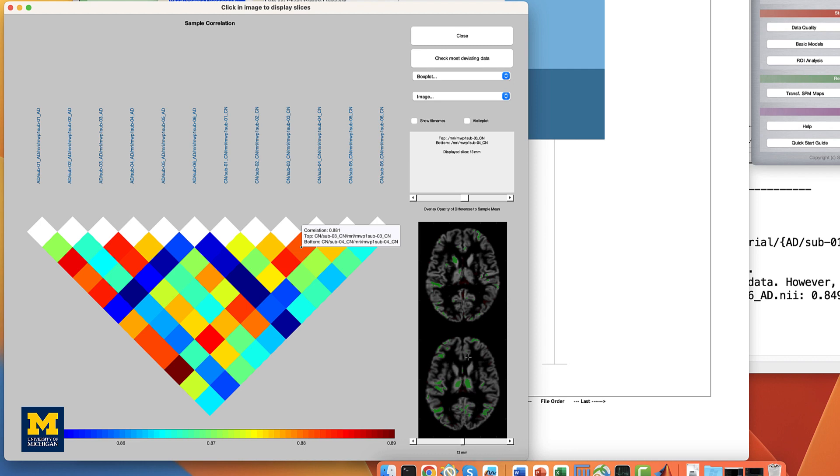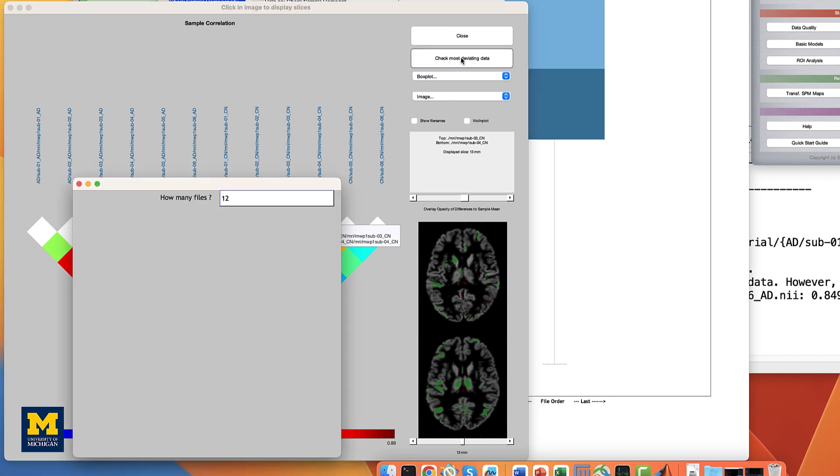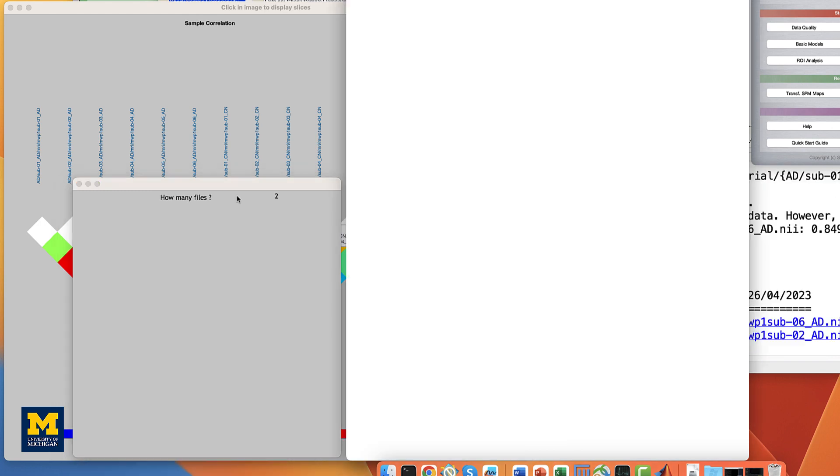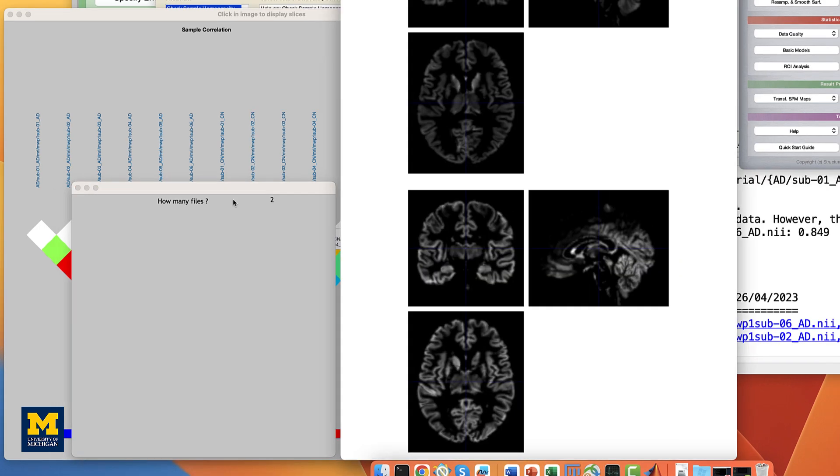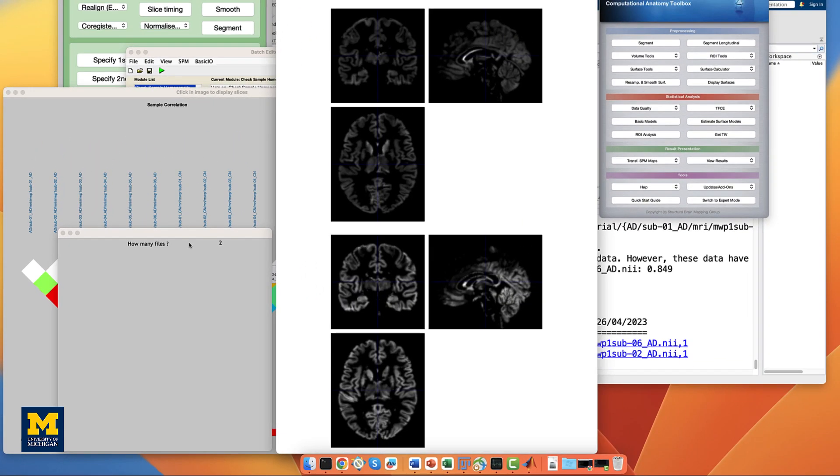You can also click on the button check most deviating data and specify the number of volumes you want to see. For example, entering a number of two will display the volumes ranked first and second in deviating from the sample mean.